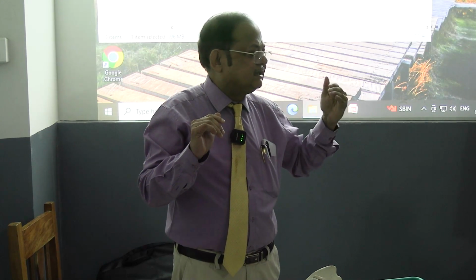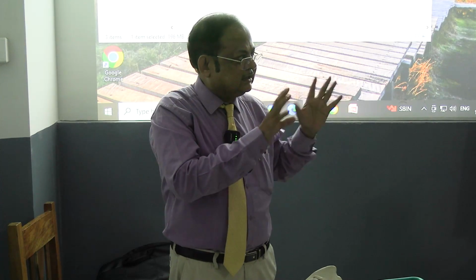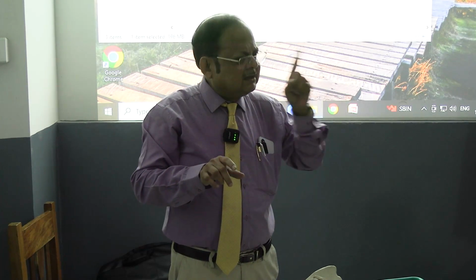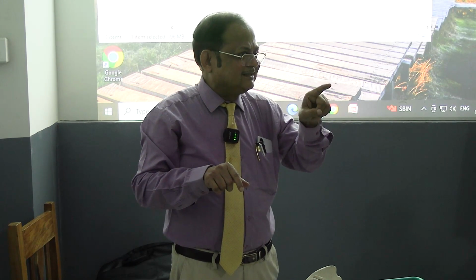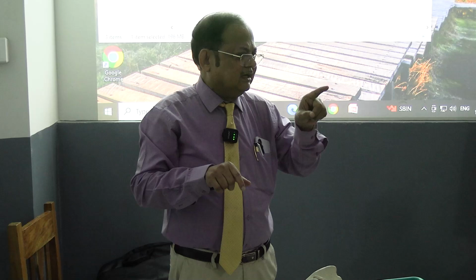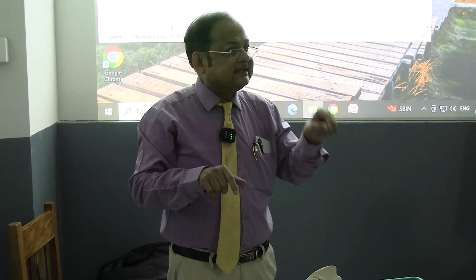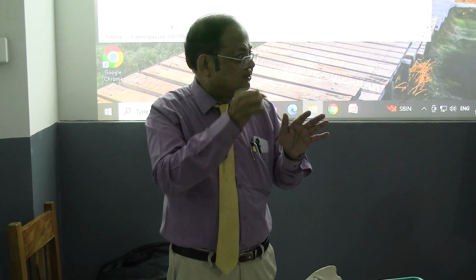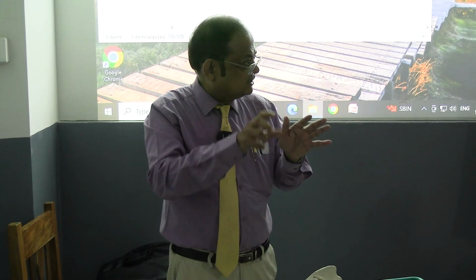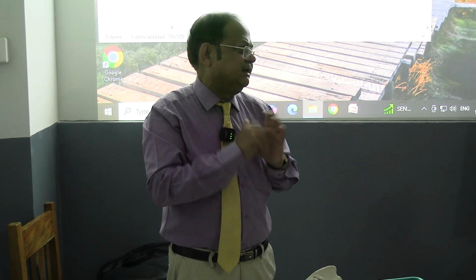The next is the criteria to be fulfilled. I will go into detail, some few more criteria. But one is that there will be full dilatation. And second, in case of forceps delivery particularly, the head will be low down and it is desirable that rotation has occurred. We must know the presentation and position, whether rotation is needed. You can rotate with the forceps or manual rotation, so that you must know.